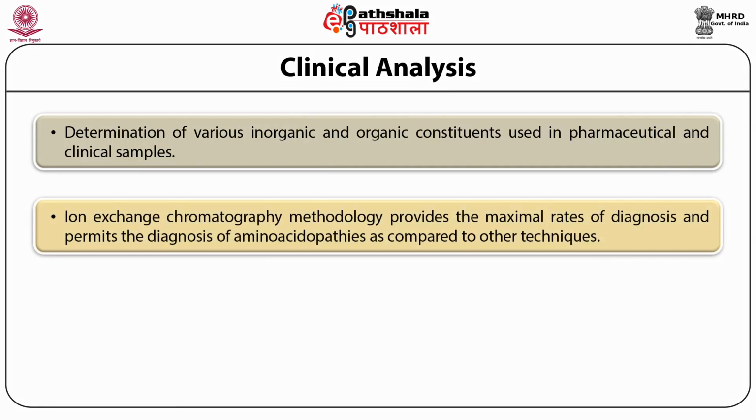It provides the maximal rates of diagnosis and permits the diagnosis of amino acidopathies as compared to other techniques, with thin layer chromatography declining to detect as the concentration of few amino acids was very little.